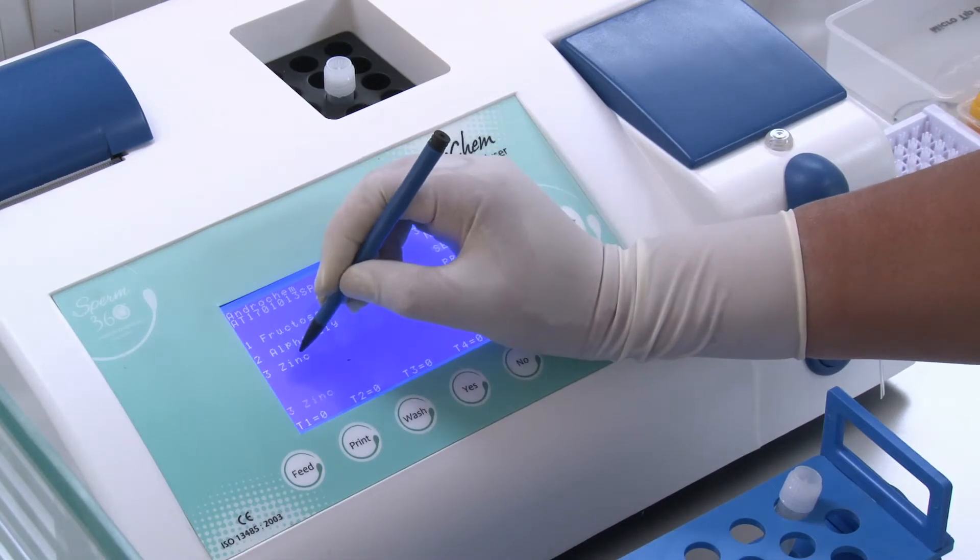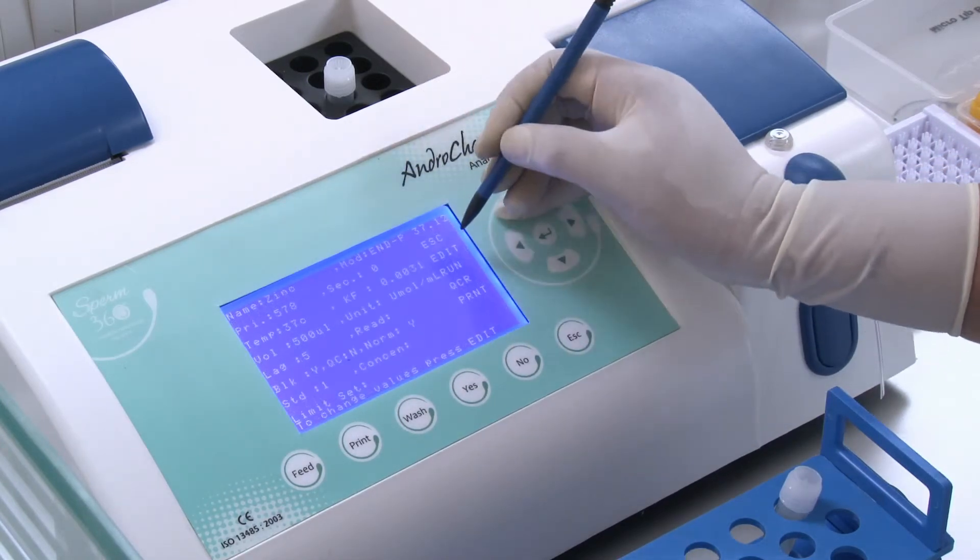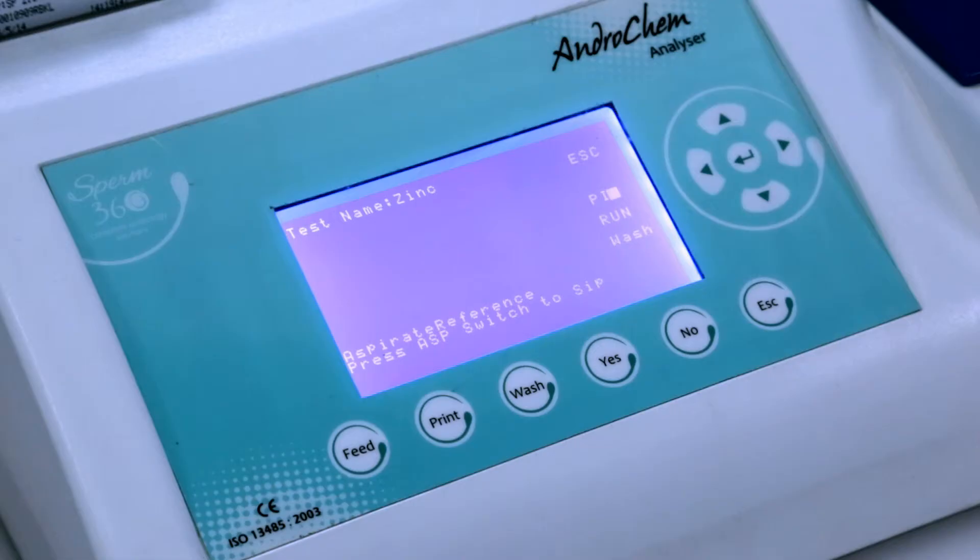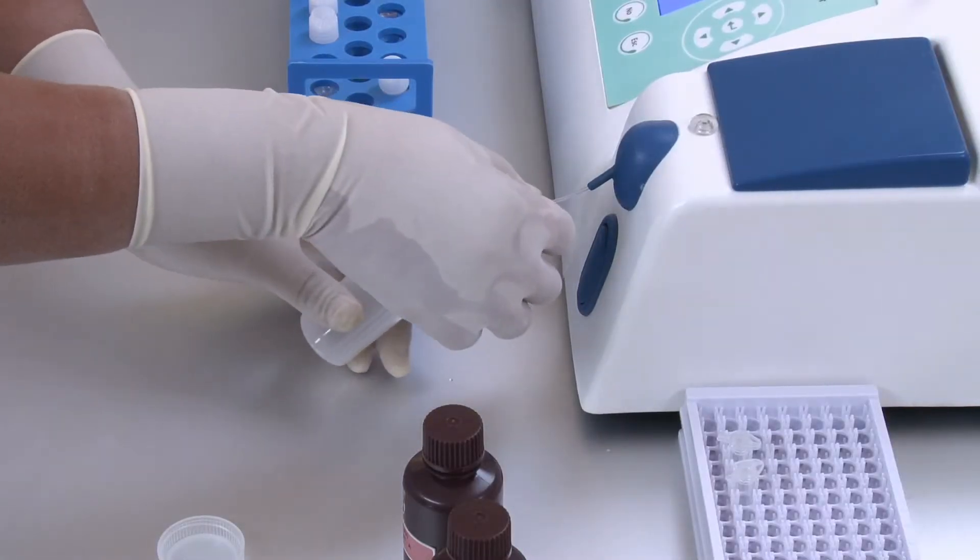Choose the program Zinc from the Androchem analyzer and choose Run. The screen displays Aspirate reference. Aspirate distilled water.